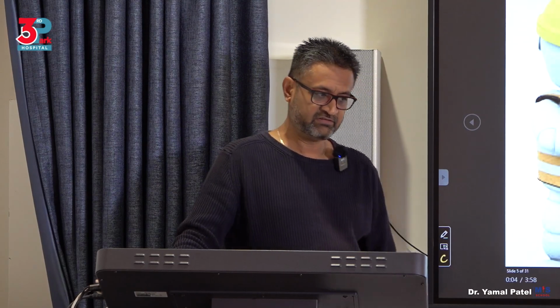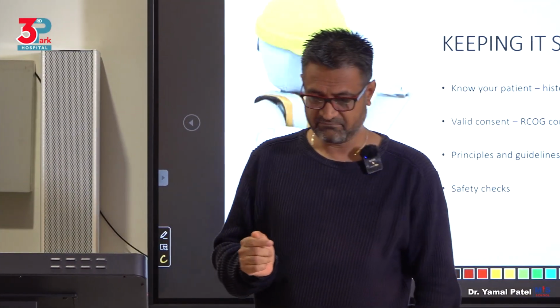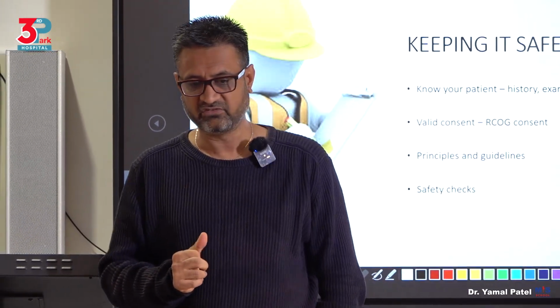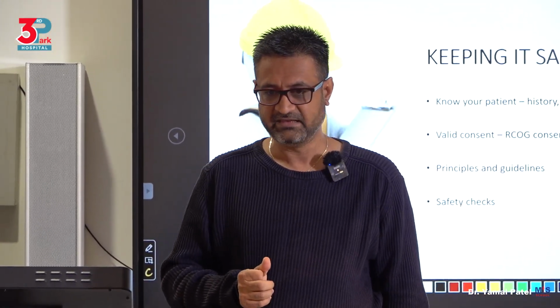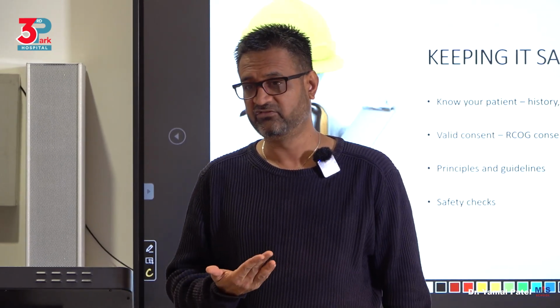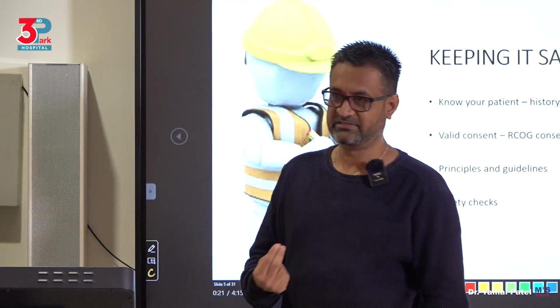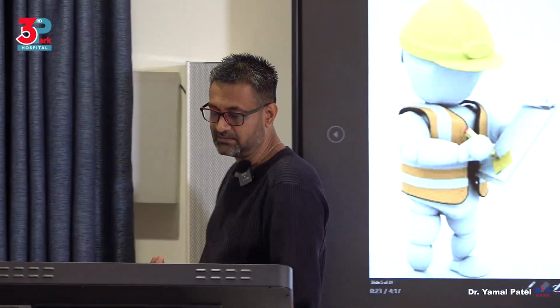I told you hysteroscopy might be a short procedure. Frankly, most hysteroscopies take me less than 10 minutes, okay? And most diagnostic hysteroscopies take me 2 minutes, okay? So it's a very short procedure, but I told you it can be very dangerous as well. So how do we keep it safe?